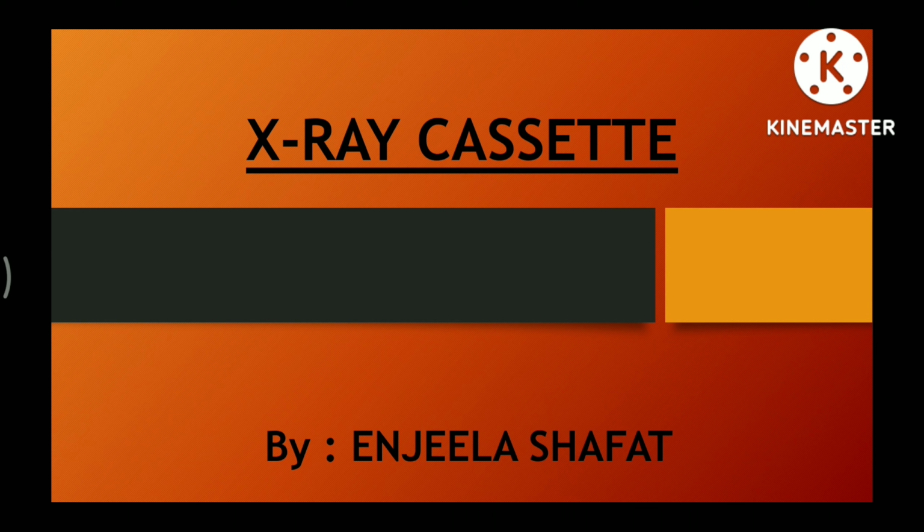Let's start today's topic, which is X-ray cassettes. As already discussed in our previous lecture about X-ray films, it must come to your mind that there should be something that can hold an X-ray film. Of course there is, and we call it radiographic cassettes. Let's discuss them briefly. In radiology, there is a square or rectangular holder made of plastic or metal that holds X-ray film, which we call radiographic cassettes.